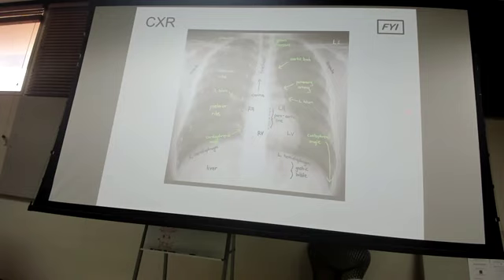But I look at this and I say, is it an appropriate study? Is it actually what I'm looking for? And does it have everything? So it has the full lungs, it's got the edges right here. I see the stomach, the diaphragm, the spine, the heart. I see all the ribs and parts of the clavicles. So that is a full chest view. That's good.